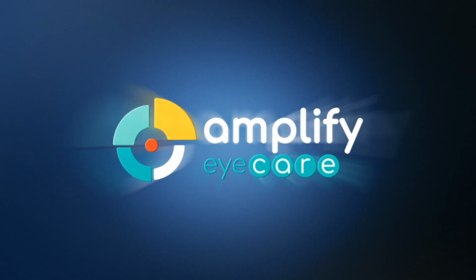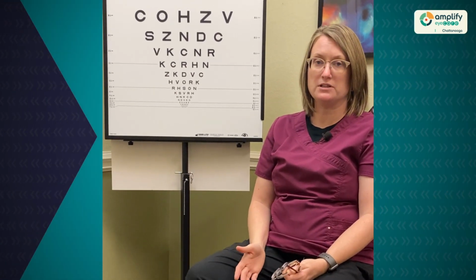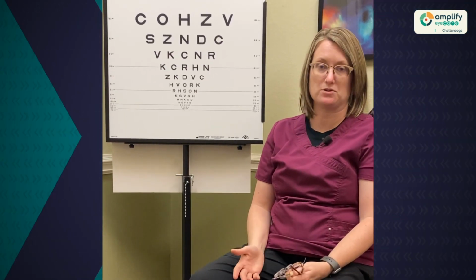When a patient comes in for a low vision examination, one of the first things that we're going to ask is, what are the patient's goals? So many times that may be watching television, it may be reading, it may be able to watch somebody walk across a stage or see a pastor at church.